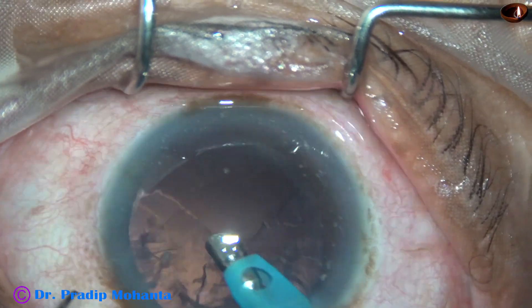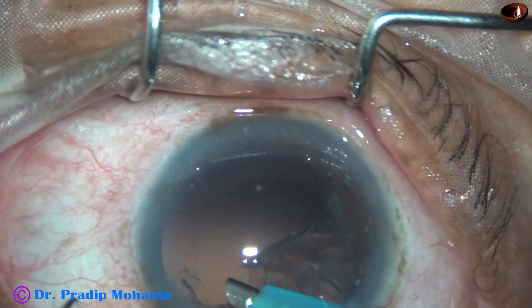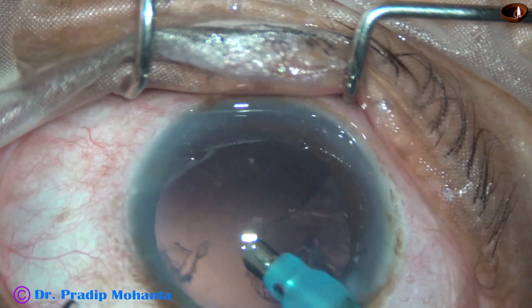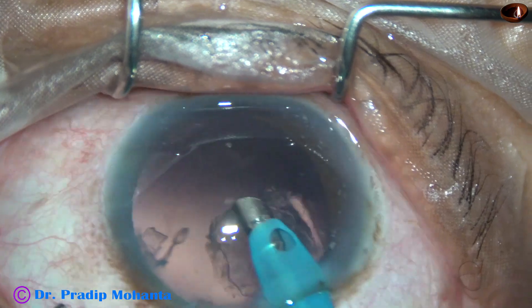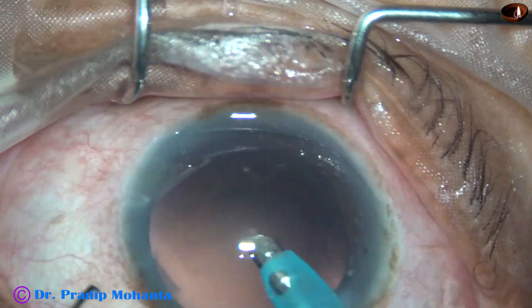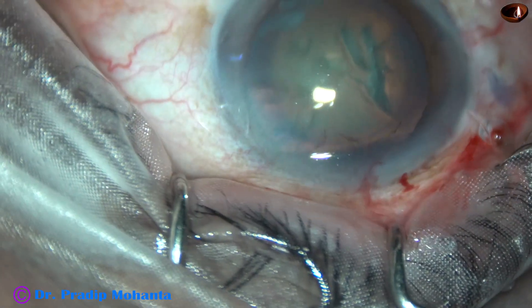Some amount of cortex is removed by the phaco needle itself. We can use bimanual irrigation aspiration or coaxial irrigation aspiration for this. But removing with the phaco needle — unless we try, we will never learn. In this case, we have removed most of the cortex by the phaco needle itself.